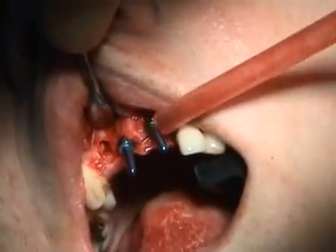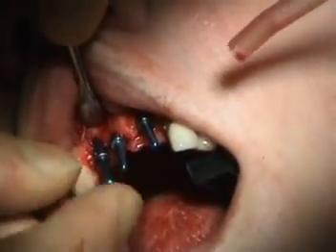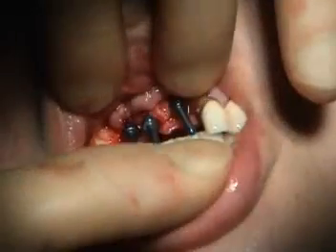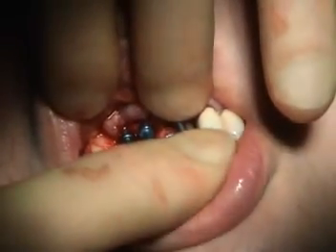Once again, guide pins are reintroduced in order to verify the occlusal relationship with the opposing teeth prior to implant placement.